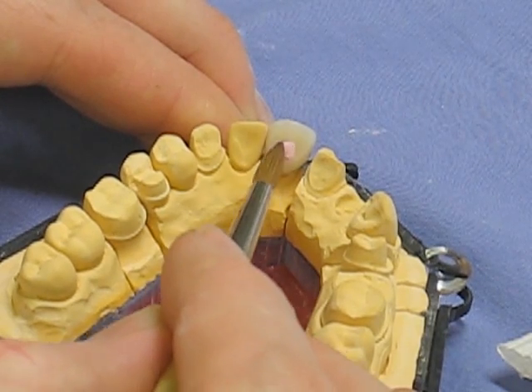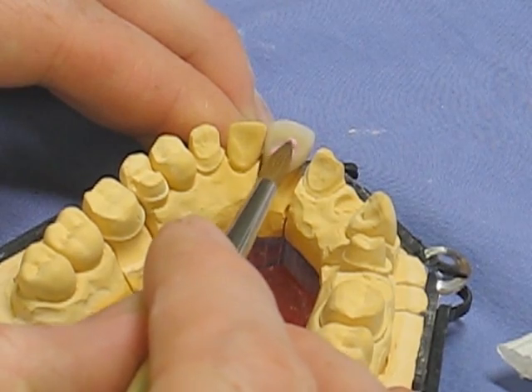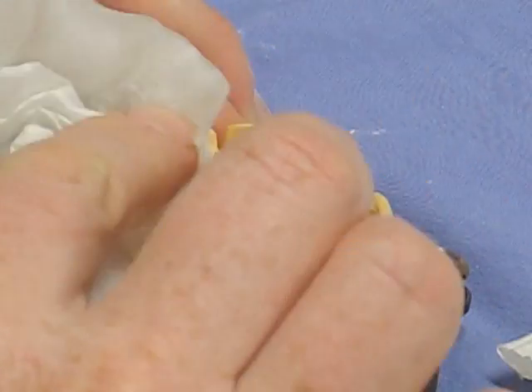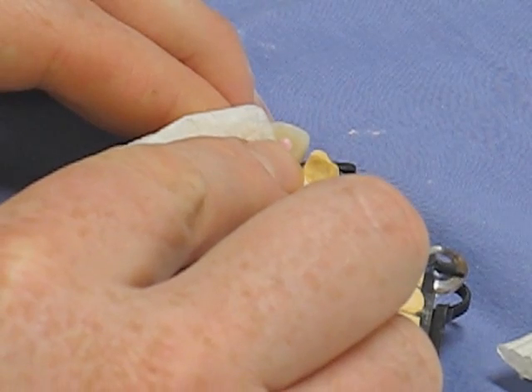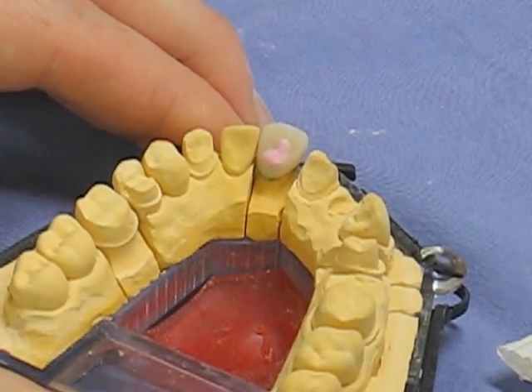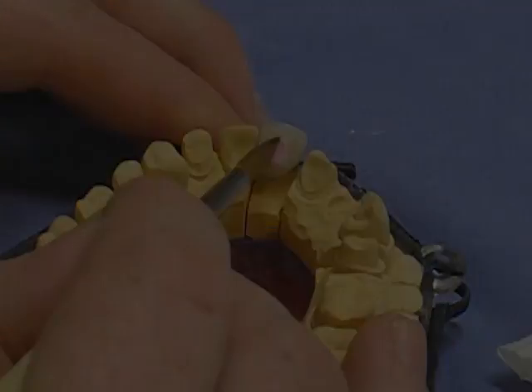A little more ceramic is needed on the palatal surface, so some dentine shades are added and the restoration goes back into the furnace for an additional firing at a slightly lower temperature so the main crown won't slump when re-fired. Making sure it's nicely condensed, it would be re-fired until the crown is at the shape you want. Job done.